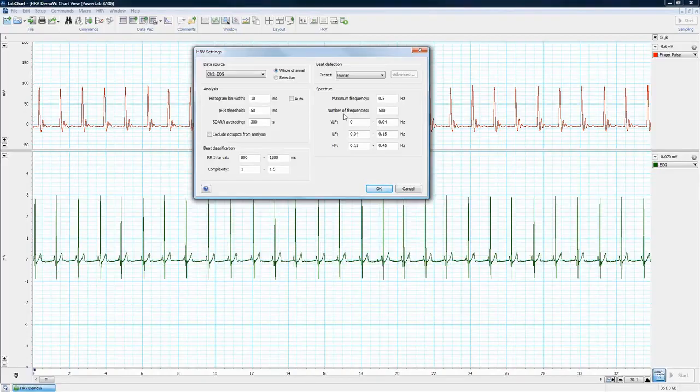The low frequency variation is normally considered to be a good indicator of sympathetic activity, and high frequency variation will reflect parasympathetic or vagal tone, and also the respiratory sinus arrhythmia. So when you're looking at HRV, these are the things you're going to be looking at, activity in these different bands, and these are the things it's believed to, and through research is shown to, correlate with, and why we're looking at heart rate variability in the first place.